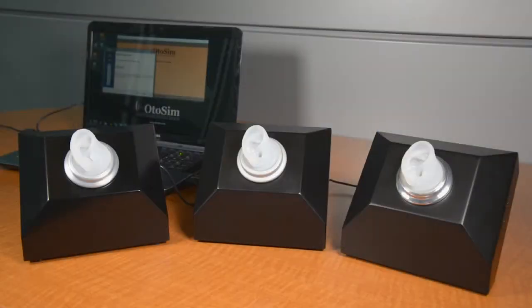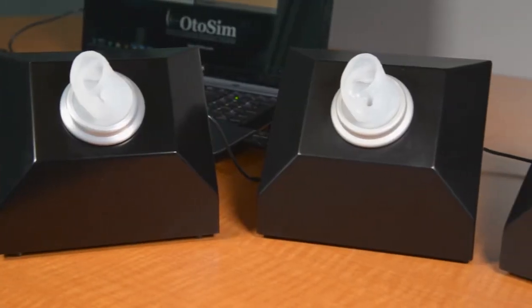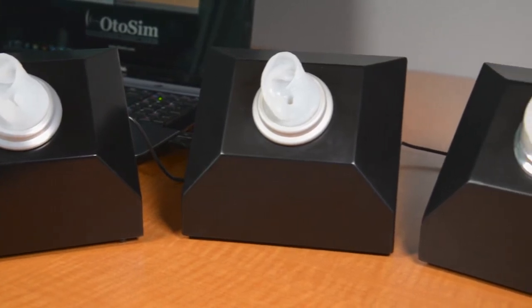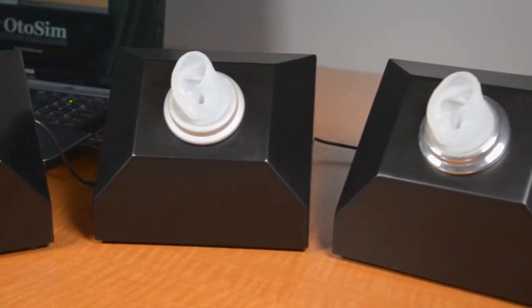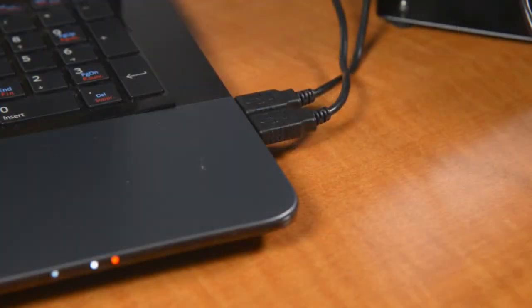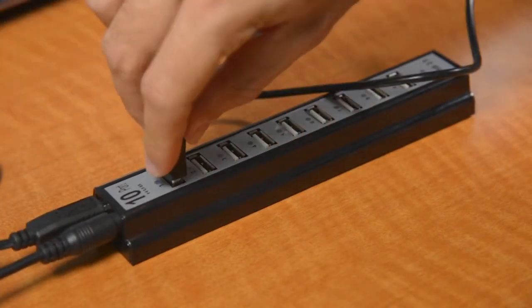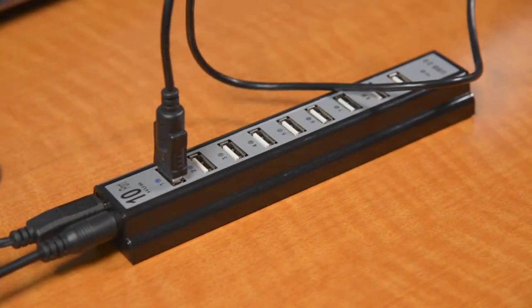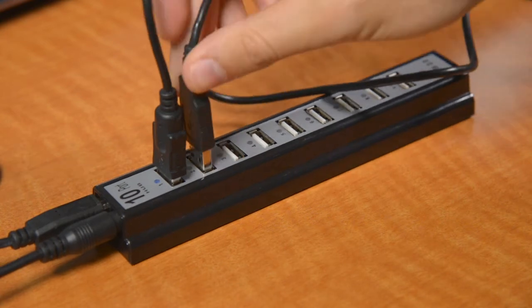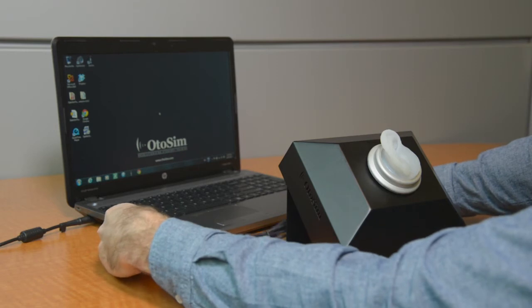Attaching Multiple Units. If you're looking to use multiple OdoSIM units simultaneously, it is important that you connect them to the computer one at a time to ensure proper configuration. Also, you can only connect two to three OdoSIM units per computer, depending on how many USB ports the computer has. To run more than three units, you will need an OdoSIM recommended multi-port USB hub.